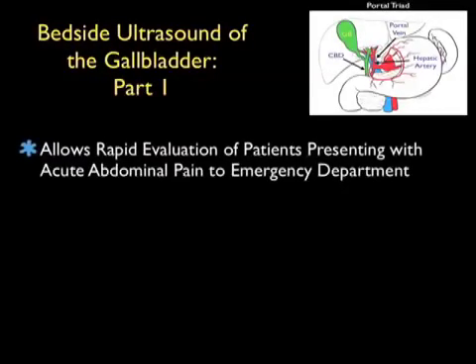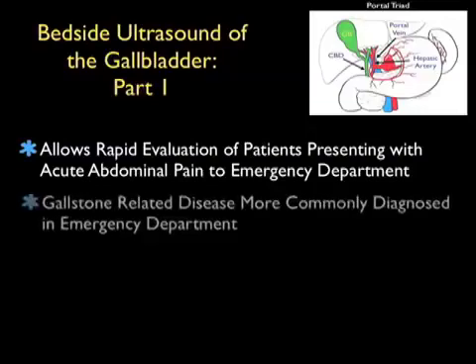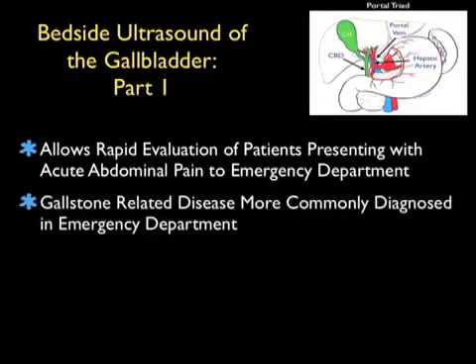In this Soundbites module, we're going to focus on bedside ultrasound of the gallbladder. I've divided this module up into parts 1, 2, and 3, and in this module, part 1, we're going to focus on the normal hepatobiliary imaging and ultrasound findings.